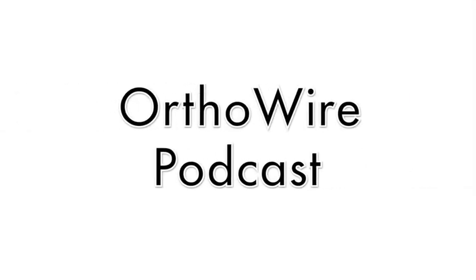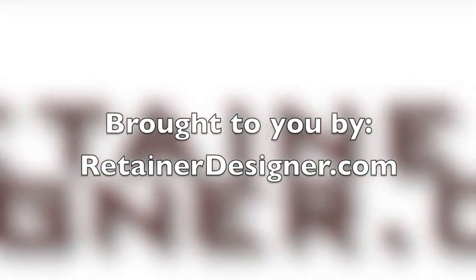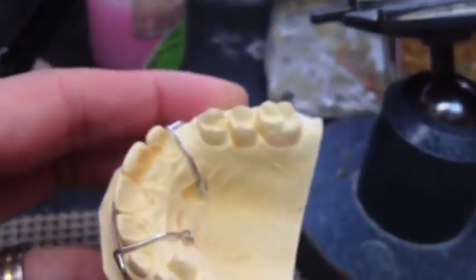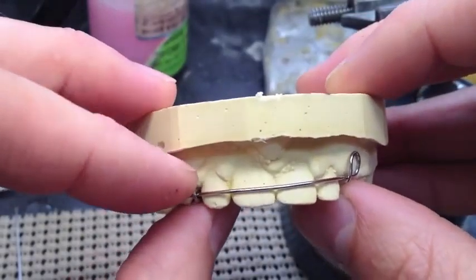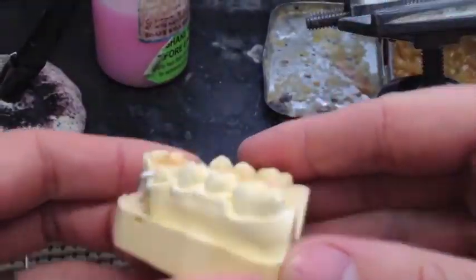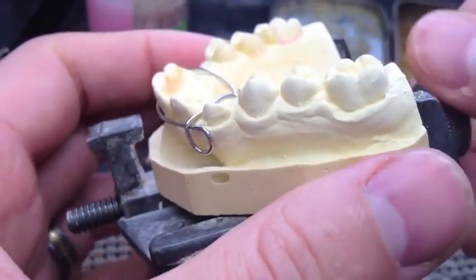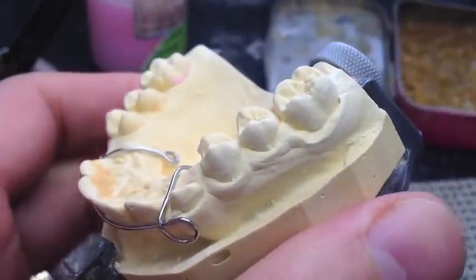I was doing an Adams clasp that day. What I probably should have included was my pre-4th Adams clasp — I used a lot of those. But here we have a pedo hawley. It's got these reverse loop labial bow, mainly used for young kids who don't have their canines in yet. This allows canines to erupt, and you can use those reverse loops to control the canines. But it's also a good chance to use Adams clasps.